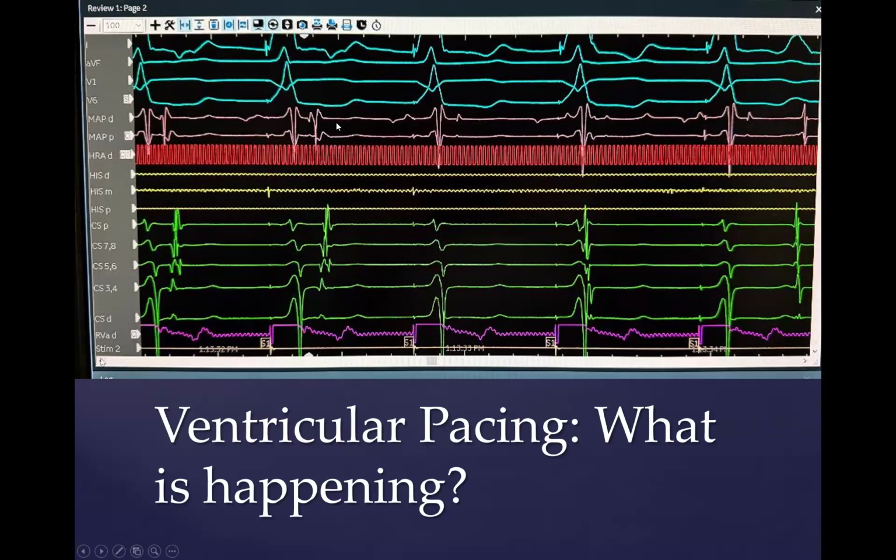But we don't really know if the catheter was maybe a millimeter to the left or the right, because it's also recording point by point on the CARTO map. But certainly the CARTO map can get us within 1 to 3 millimeters of the correct location. And in the worst case scenario, you could at least go back and burn around that area with 2 or 3 applications and likely get the pathway. This is a major advance over the past.